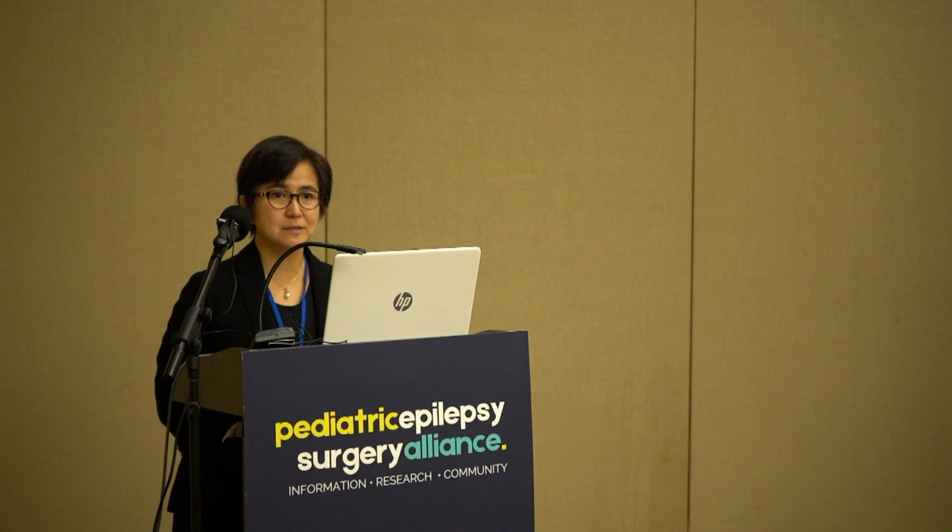I would say most institutions that do high volume epilepsy surgery would do it on 3 Tesla, except if there are any contraindications to doing it on 3 Tesla. So in the vast majority of cases, most people would now do the scan on 3 Tesla in level 4 centers. So if it doesn't say it, I can assume that it was.